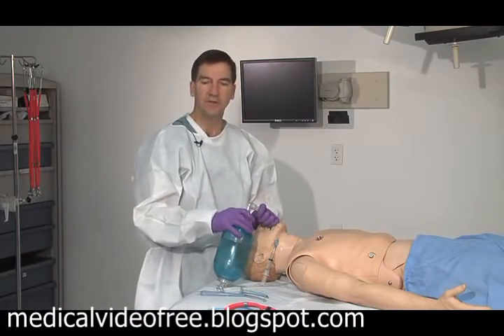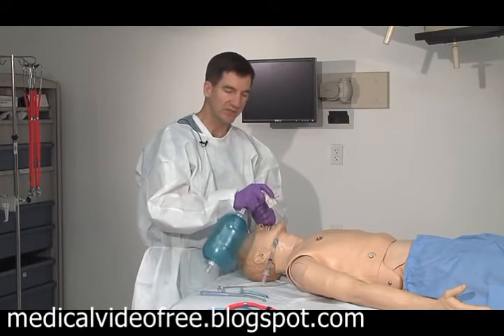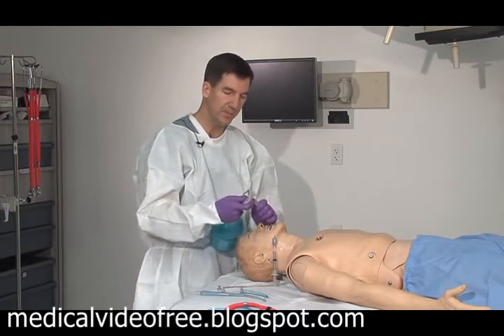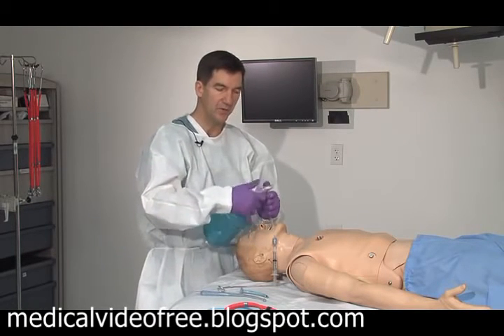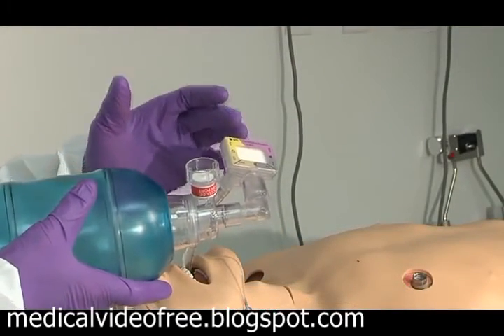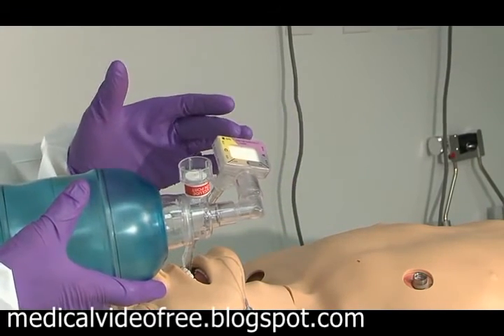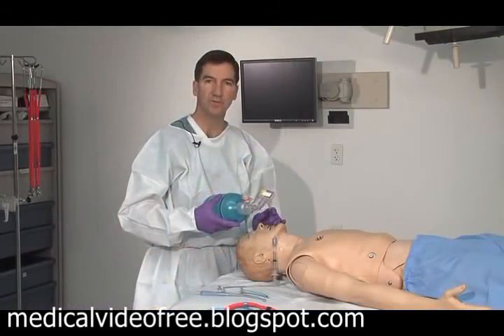An additional device is the end-tidal CO2 monitor. Once the patient has been intubated successfully, this device allows you to double-check and make sure that you're in the trachea. By placing this device between the endotracheal tube and your bag, you're able to watch for a color change that witnesses the CO2 level rising with your resuscitation. Normally the color is purple when it comes out of the bag, showing low CO2 concentrations, and you expect to see this change from purple to tan to yellow, letting you know that you have successful intubation.